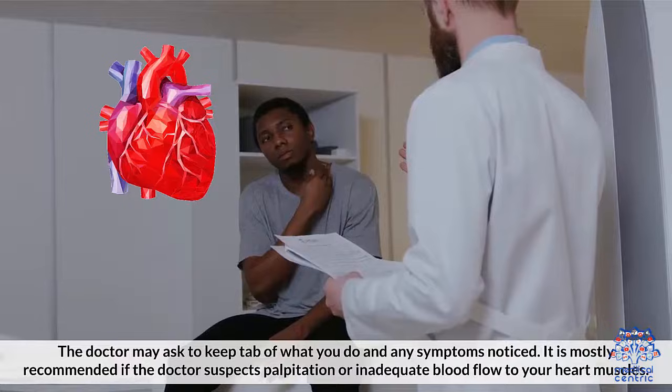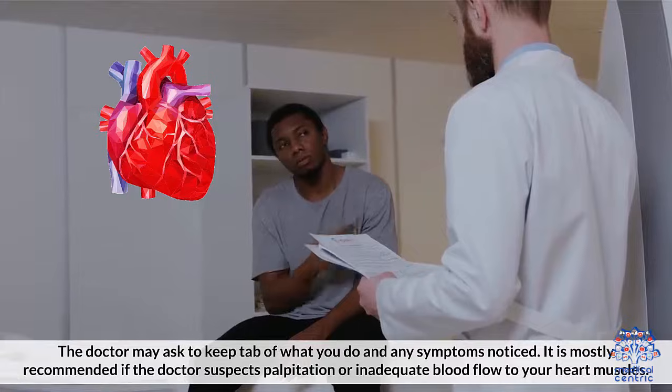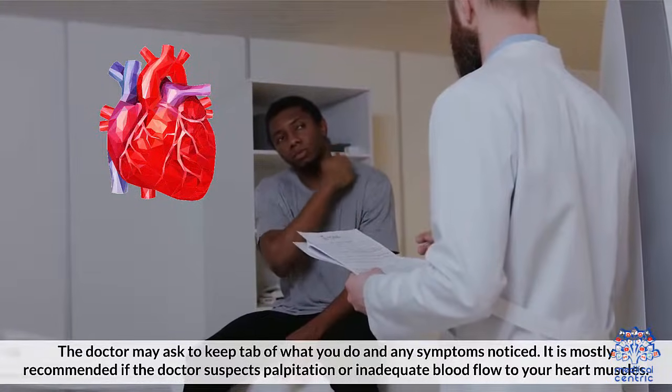The doctor may ask you to keep a record of what you do and any symptoms noticed. It is mostly recommended if the doctor suspects palpitation or inadequate blood flow to your heart muscles.